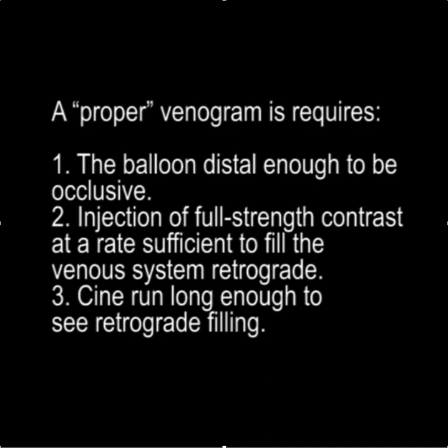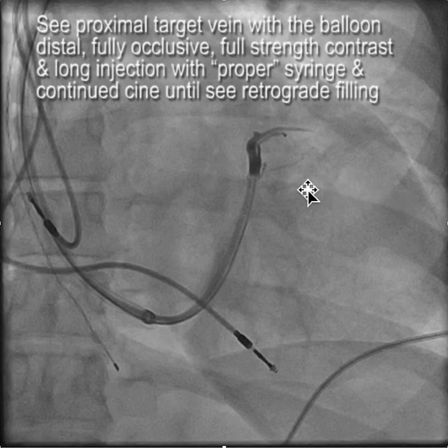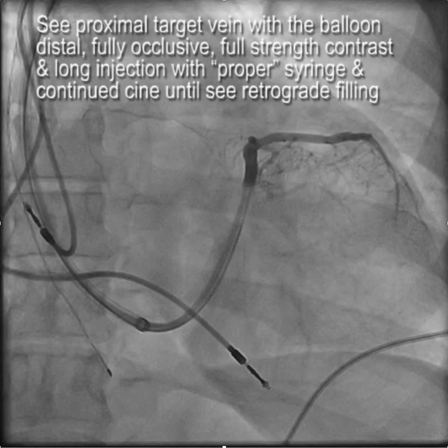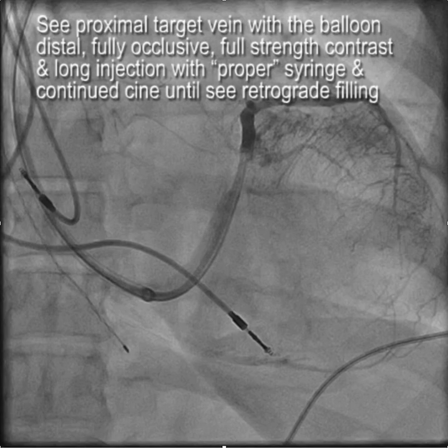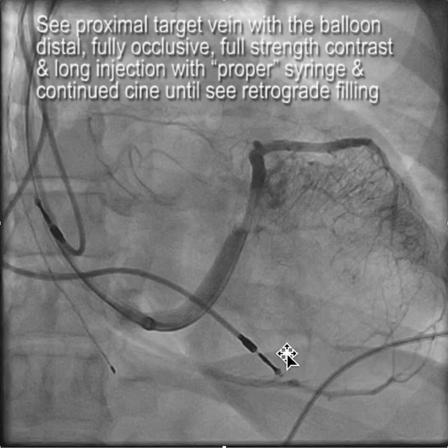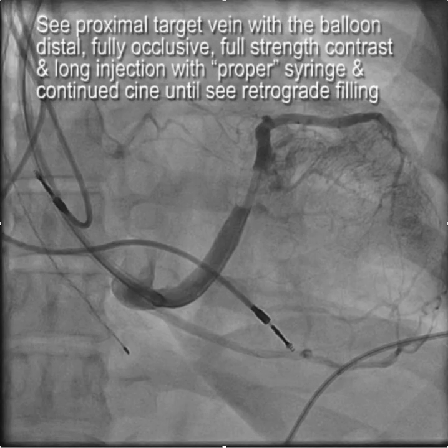Seeing that the venogram was inadequate, I suggested that we put the balloon more distal. In order to see proximal target veins with the balloon distal, it needs to be fully occlusive, you need full-strength contrast, and you need a long injection with a proper syringe and continued cine until you see retrograde filling. We have the balloon distal, we're using full-strength contrast and the proper injection syringe. With that, we now see this proximal branch that turns out to be the target vein.